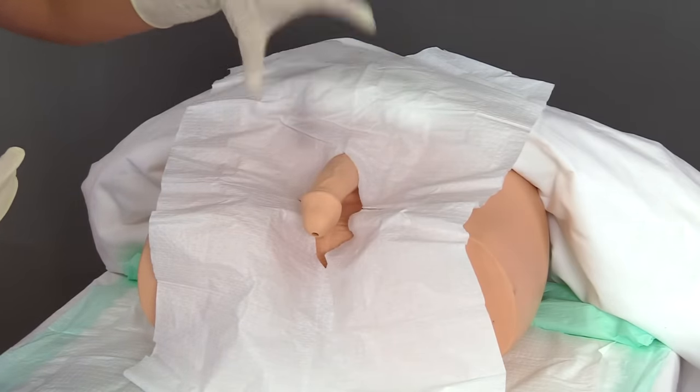It's been three minutes, so now we're ready to insert. Hold the penis up at about a 90-degree angle and grasp the catheter tubing about five inches before insertion. Have the patient breathe in and out to distract them and help relax the urethra. On an exhale, insert the catheter and push it through, advancing all the way up to the bifurcation. Observing urine confirms you're in the bladder — follow your hospital's protocol for how far to insert.